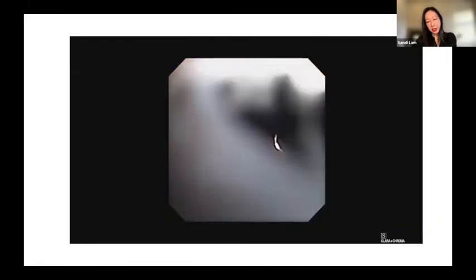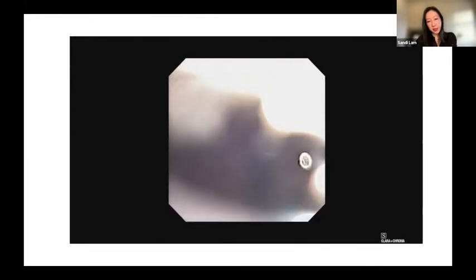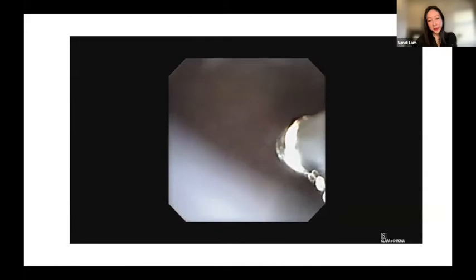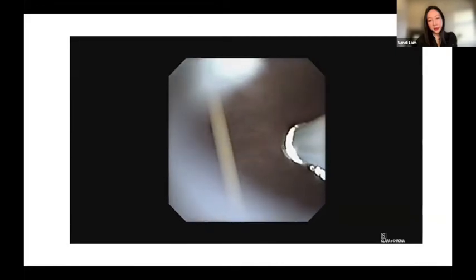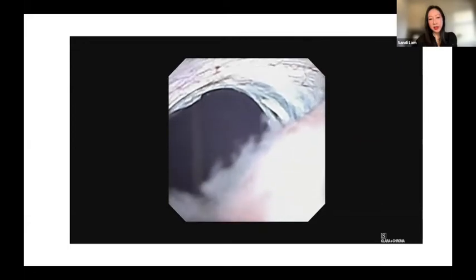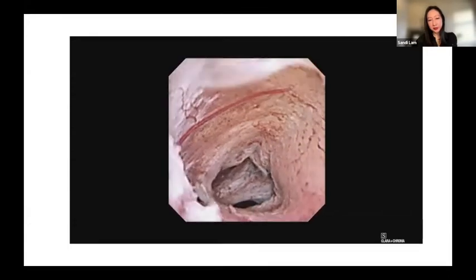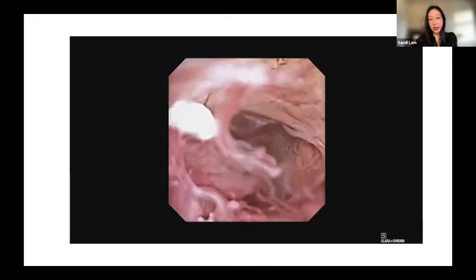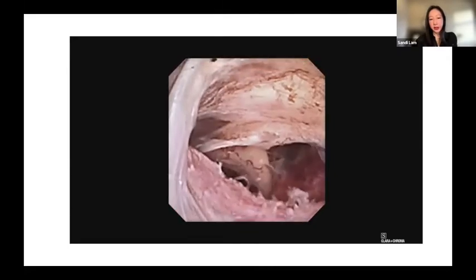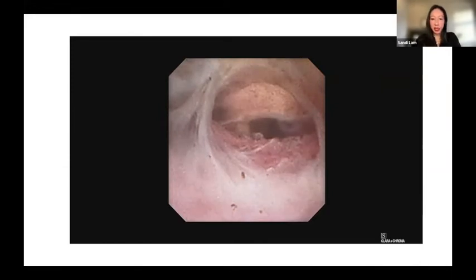Once we're through those adhesions and hydrodissecting as well, you'll see that we're in an area where it appears different. We're actually in communication with the rest of the ventricular area now. And then there's the shunt catheter that was on the other side. So now we have simplified that system so that this one shunt and one shunt catheter is able to drain that entire loculated system. That was not entirely straightforward. We could have tried that with a rigid endoscope to find a straight path and trusted the navigation, or we could have been patient to try to manipulate through that.